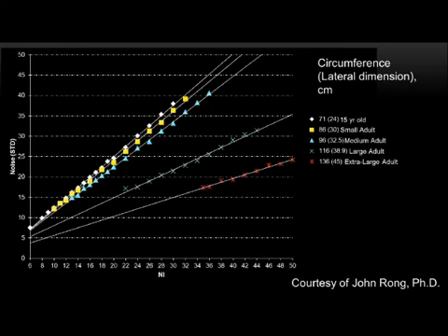The behavior at the same noise index is pretty consistent, right? You've got standard deviations in noise that are all in the same ballpark. But all of a sudden we go to this large phantom, and even though we're at a noise index of 26, my noise in this image is at 18, and my noise in these smaller patients is at 25 to 30. So depending on body habitus, the systems may not actually match image quality across all patients.